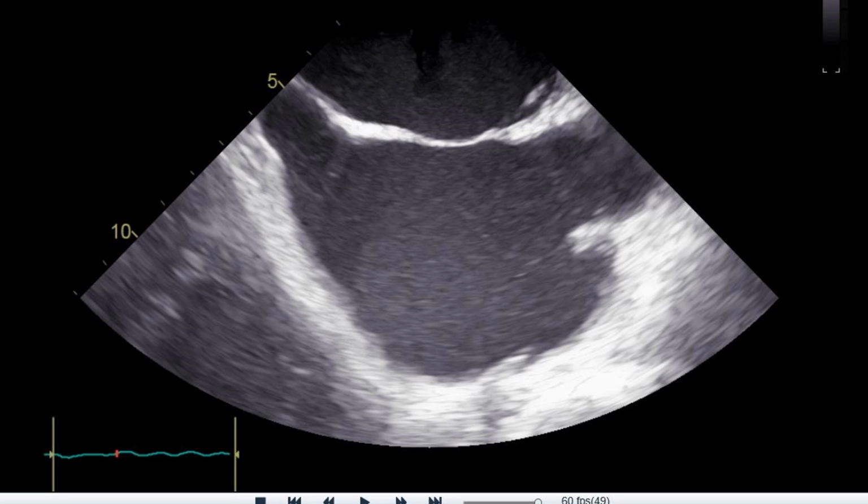The other thing that will be useful is if your surgeon is placing ECMO lines. So one of the nice things about this view is because it's the IVC, when lines come up the venous system into the groin, you can see them coming up this way. So what will happen is you'll see wires and you'll eventually see an ECMO cannula, and it usually sits right about there in the right heart. So you're able to help surgeons with line placement.